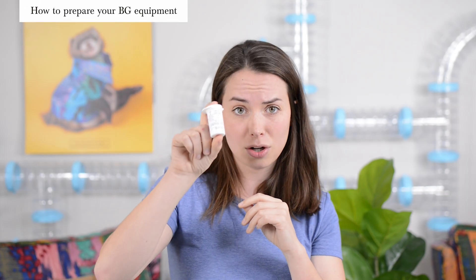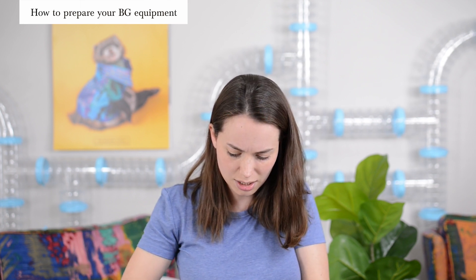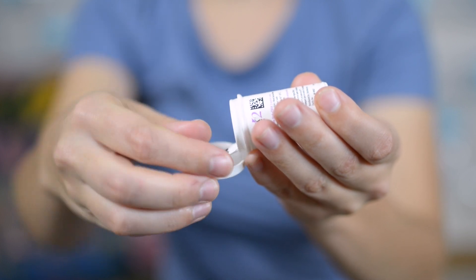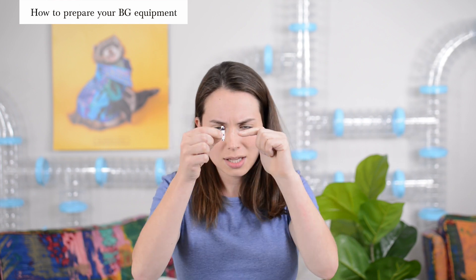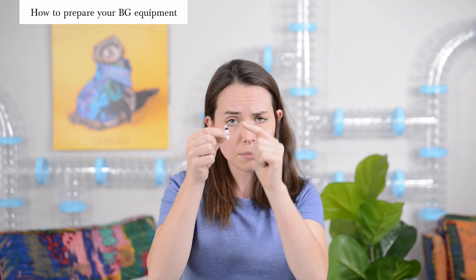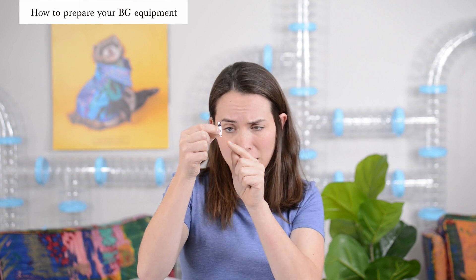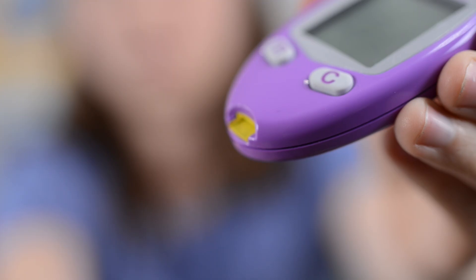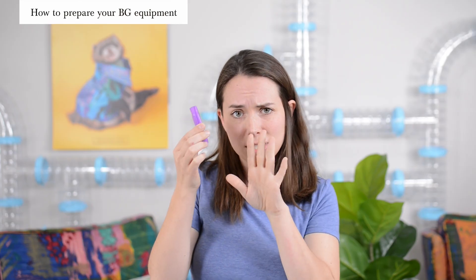After setting the correct code, pull out one test strip without shaking. Try not to touch them all. A good technique is to open the bottle and turn it upside down so the lid catches the strips and you can grab one more easily. It's very important not to touch the top or the bottom — the black areas. The top goes into the AlphaTrac monitor and needs to be clean, and the bottom interacts directly with your ferret's blood. Touch it only in the middle. We also recommend not pushing it all the way in yet so it doesn't turn on the monitor before you're ready.